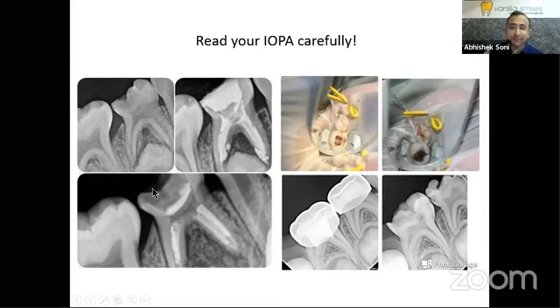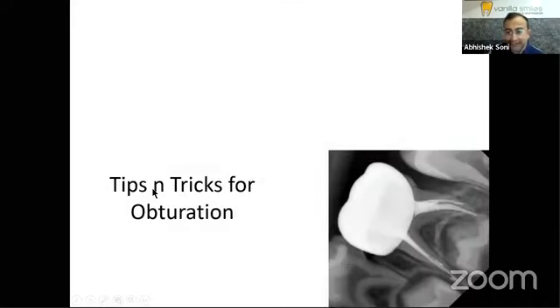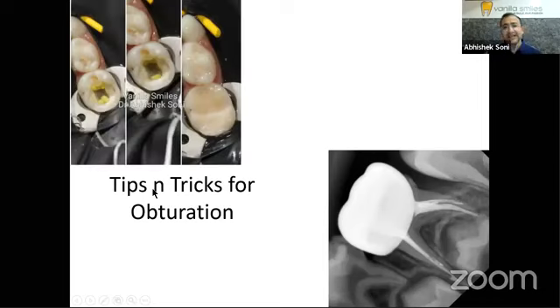If you have a pulpal exposure where you have profuse bleeding at the exposure site, which is not able to be controlled with your sodium hypochlorite or your pressure pack, then you know you have to go into your pulpotomy. After your coronal pulp amputation, after 3 to 4 minutes, if the bleeding does not stop, then you know that you have to go in for your pulpectomy. So that's how you can use your radiographs as an effective tool to decide what the child is going to need and eventually prepare your armamentarium otherwise.